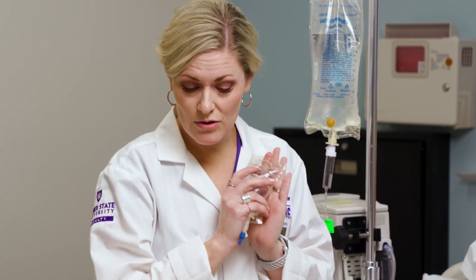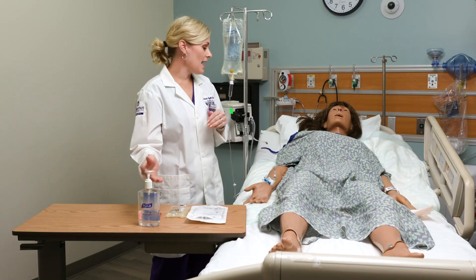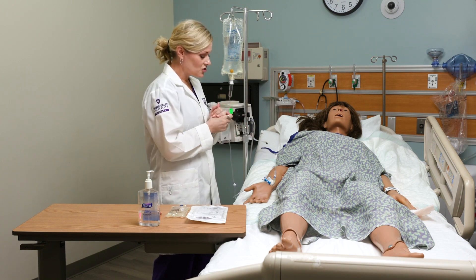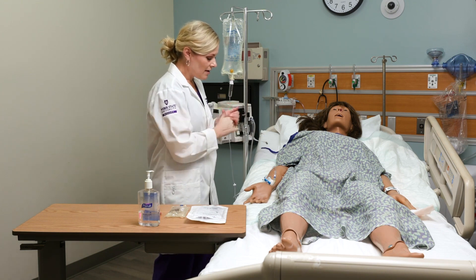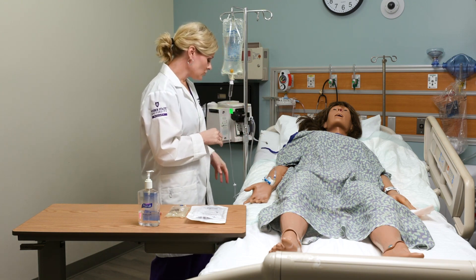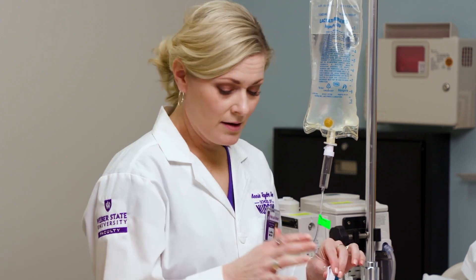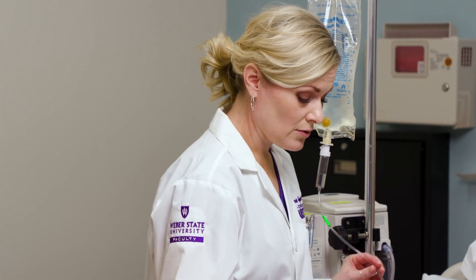I come into my room, do hand hygiene, and introduce myself to my patient. I'm going to check the IV site to make sure it's flowing okay if they have primary fluids running. Everything looks good here — no signs or symptoms of infiltration or phlebitis. I'm going to close my roller clamp when I attach this. For my exam, I'm going to make sure that's closed.